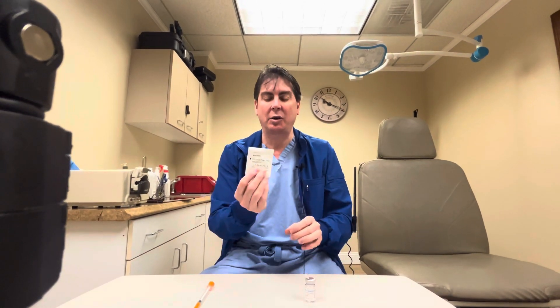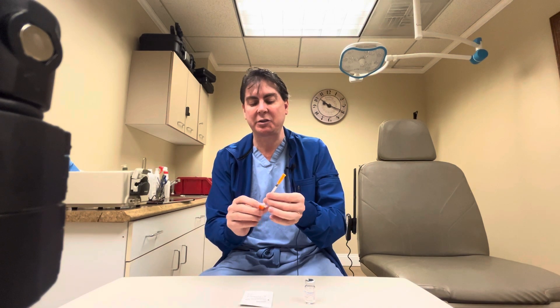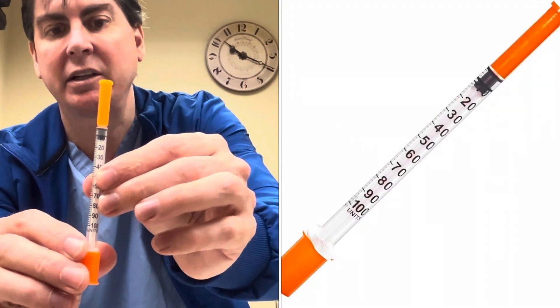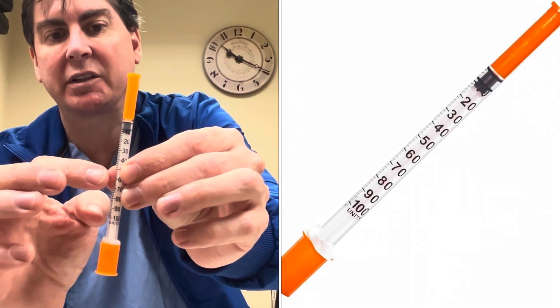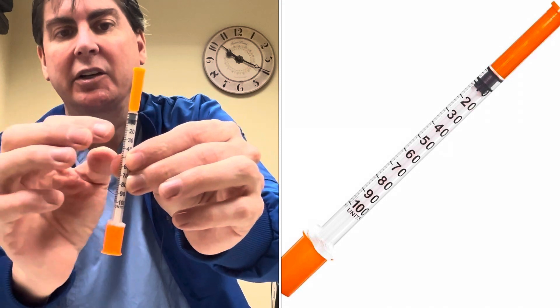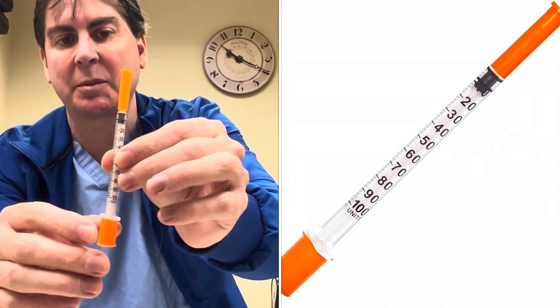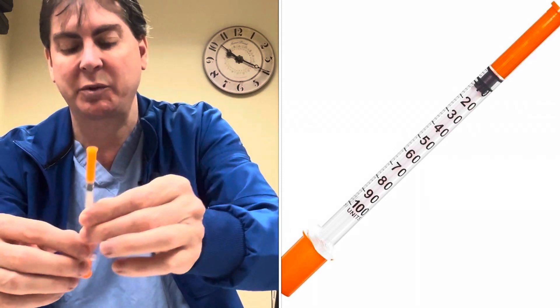You will have three things: you will have the product itself which is refrigerated, you will have an alcohol pad, and you will have the insulin syringe which goes up to a hundred units. It's marked off in units of ten all the way up to a hundred. Your first injection is only going to be ten units, so it's only going to be up to ten percent of this and I'll show you as we go.